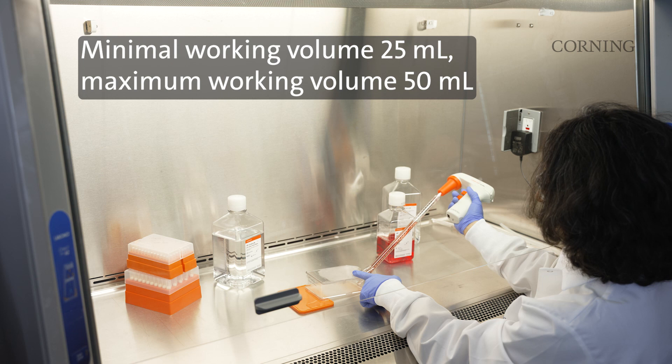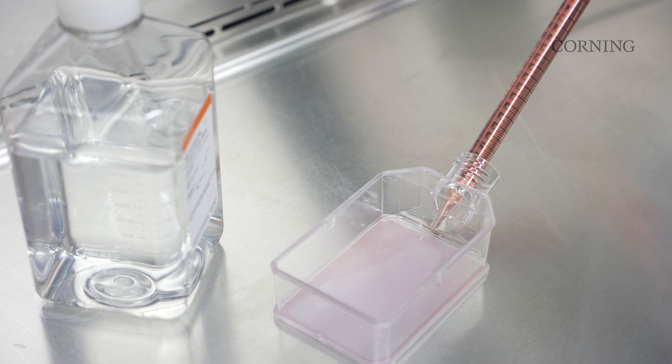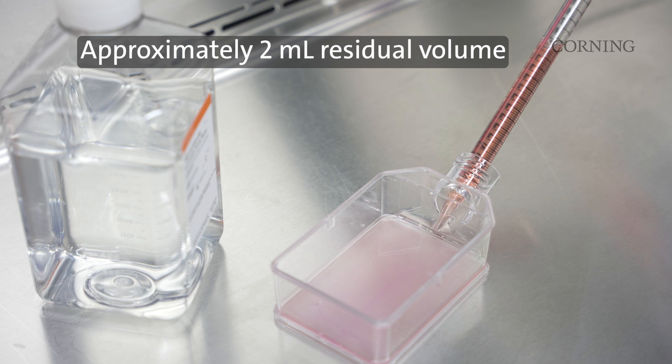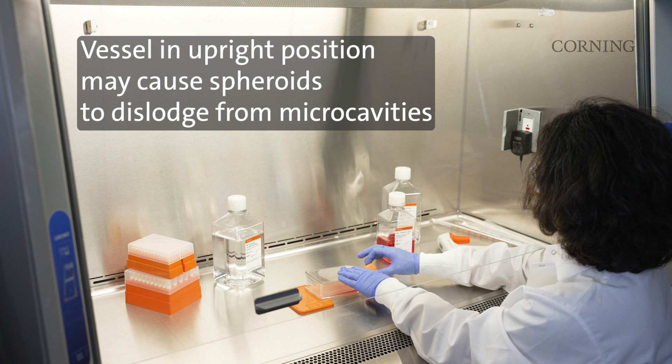A similar medium exchange can be done leaving the flask in the incubation position for media removal and addition. A residual spent medium volume of approximately 2 milliliters will be left in the vessel. Once the medium exchange is complete, gently remove the angling device and bring the flask back to the flat incubation position. Recap and transfer back to the cell culture incubator.